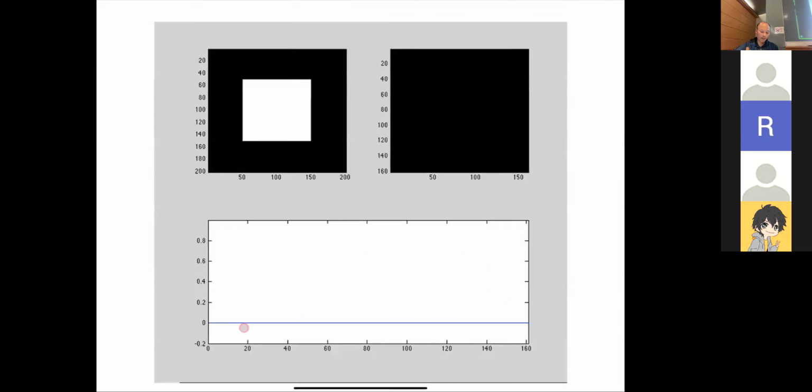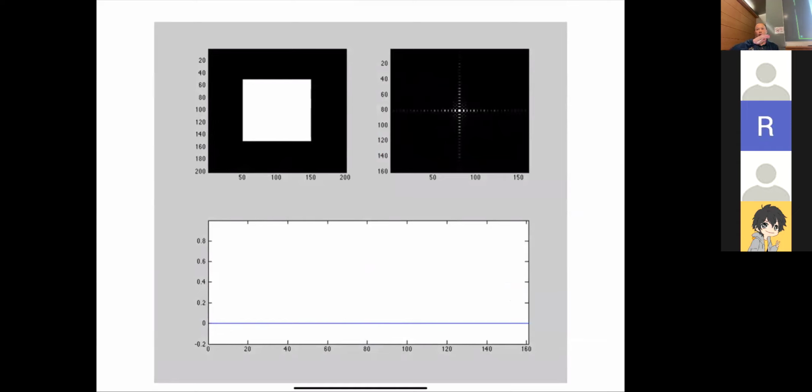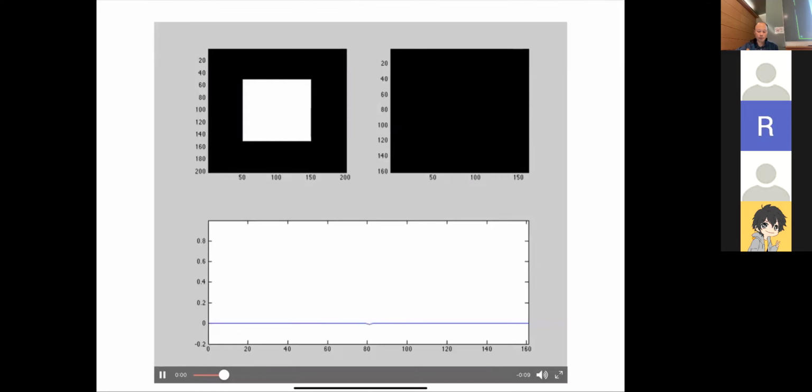In this example, I have my object here. Every time I go through k-space, I'm going to show you a line through k-space, and every time I get one of those lines, I'm going to store it in this array. Okay, so let's see what this looks like. You can see the signal is fairly small until I get close to the center of the sinc, and then you see the signal go up, and this corresponds to this part. Okay, I'll play it one more time. So this is what it would look like if you're acquiring MRI data.